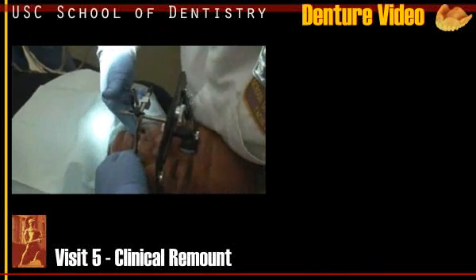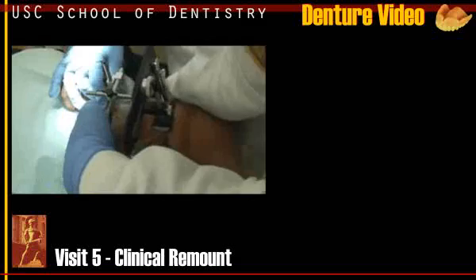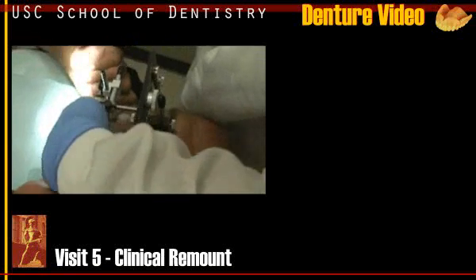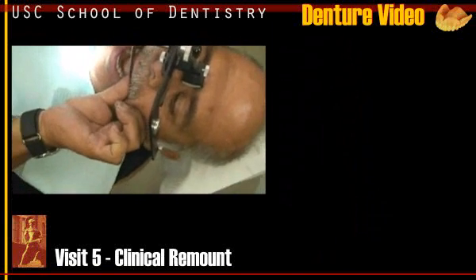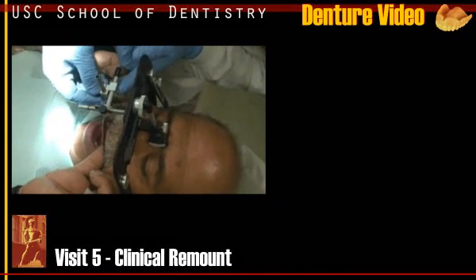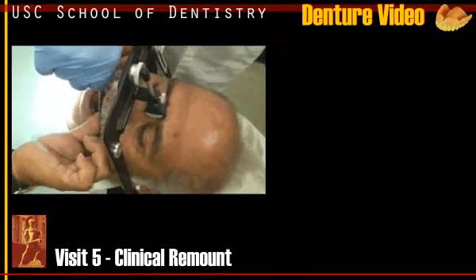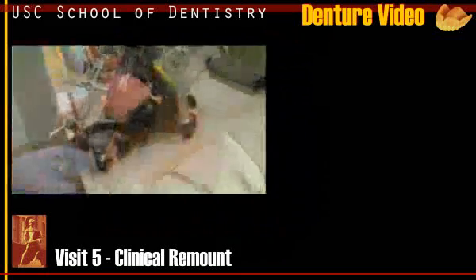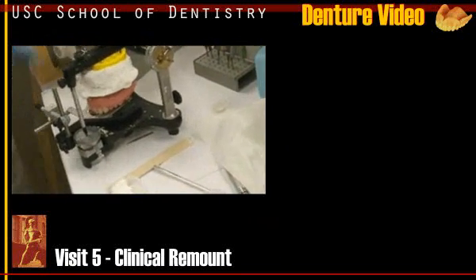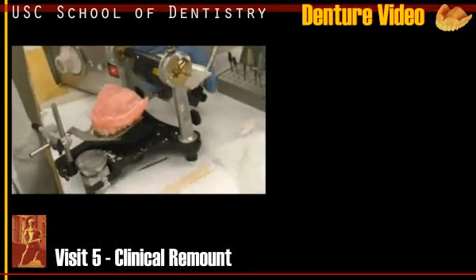Okay, that's fine. Could you help me to press it down? Upper one with the thumb. Okay, like this. See, he remembers. I'm trying to make it as accurate as possible. And then I tap the lower one, and then I tap the upper one, right? And then just let it go. Okay, make sure this is not hitting. Of course it's not going to hit because there is a stone there, right? So don't have to worry about that much.